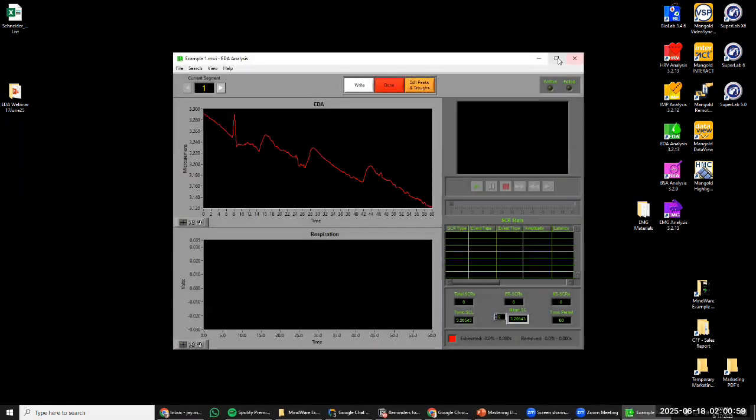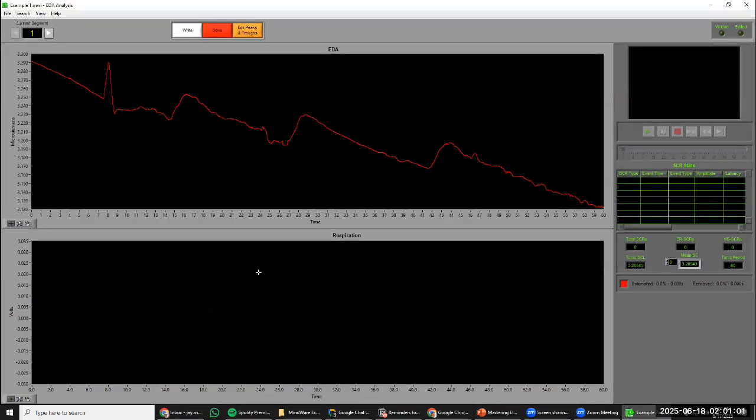Hitting the analysis here, we can look at this waveform. If we were to see something like this, this is that jaggedness that I was talking about, compared to the slow rolling hills that we are expecting.